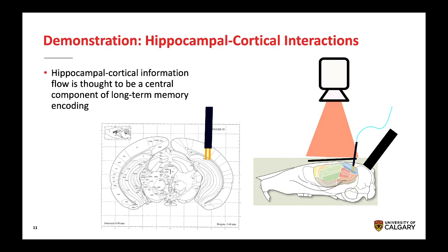So we will adjust our base preparation with a small craniotomy positioned posterior to the imaging window. This craniotomy allows the insertion of a single or multi-site electrode, and we can precisely control the orientation and position of this electrode with a multi-axis micro manipulator.